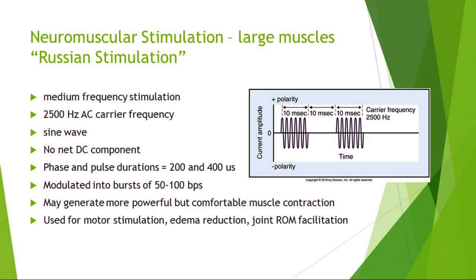It may generate a more powerful but comfortable muscle contraction. Your mileage may vary. Everybody feels things differently. Some people feel like Russian is super bitey and they like to use other applications. Some people love Russian. So try them out. We're going to try them all out in lab and see what you like.